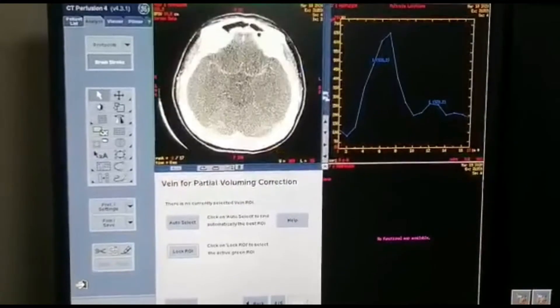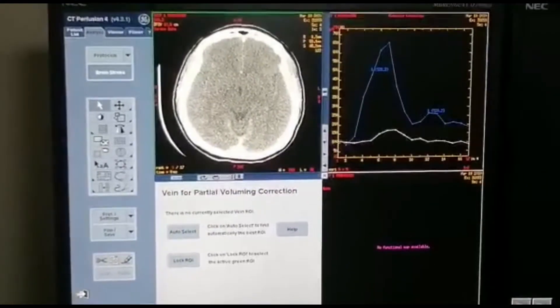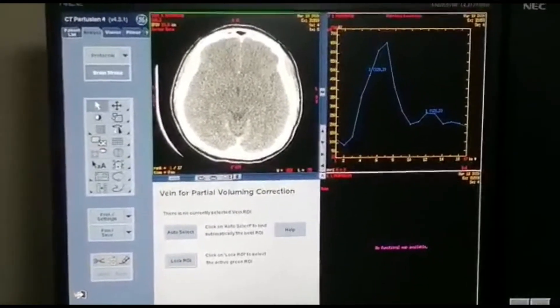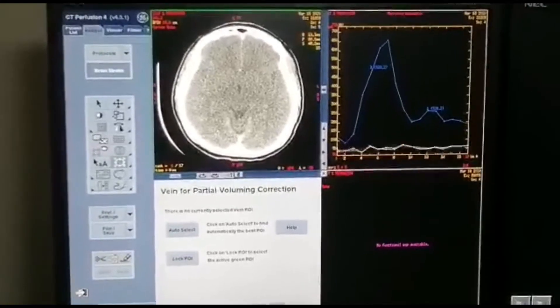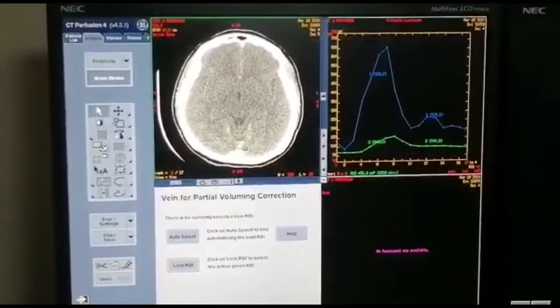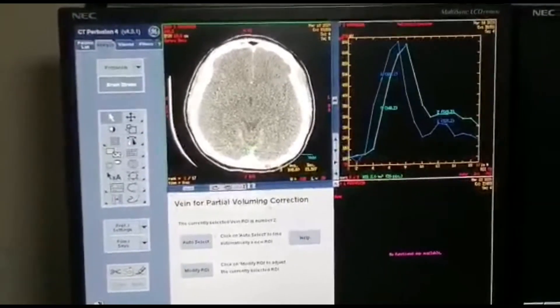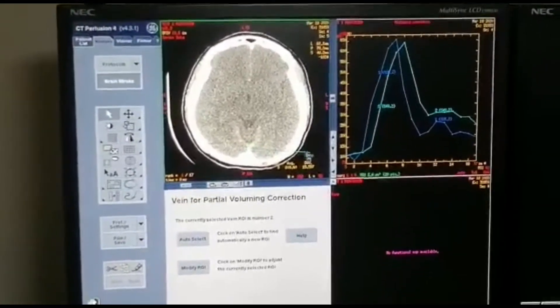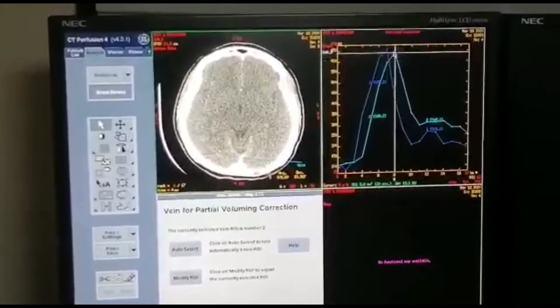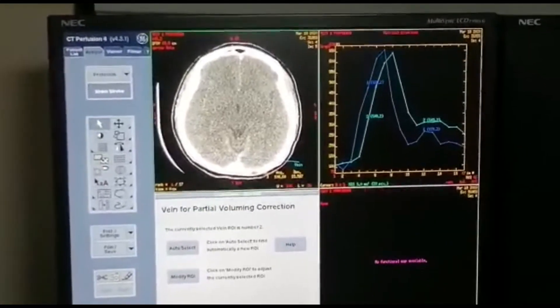I just want to scroll until I see the correct view, like this one here. Again, select the region of interest and click here. Make it smaller. Make sure it's marked for the vein, and make sure you have a gap here between the vein and R3. And then go next.